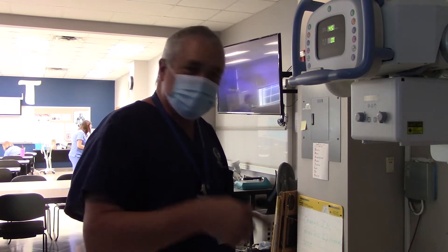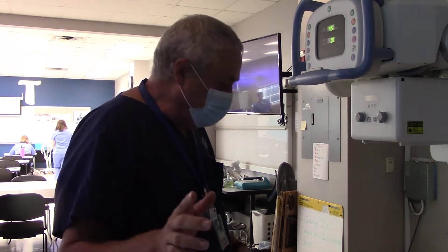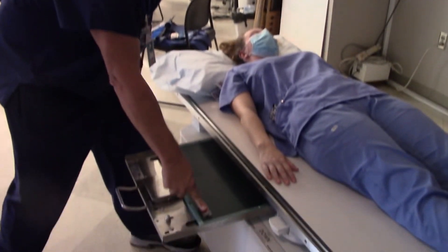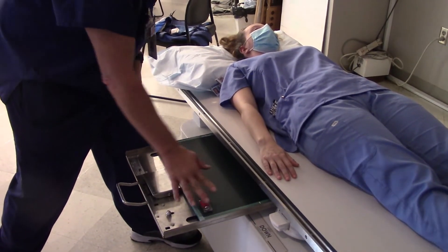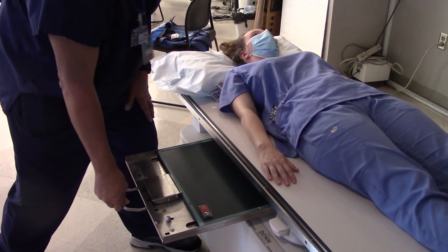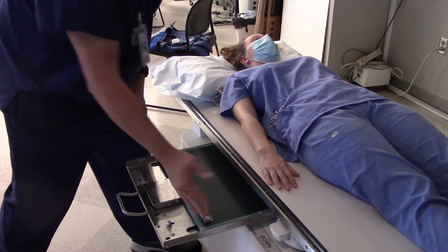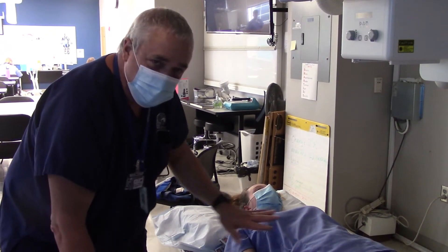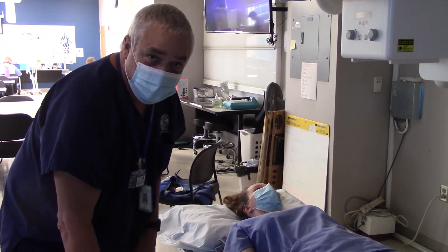For the supine, we've got our patient laying on the table with an image receptor in. We've got our marker down low — that's going to put the marker in the femurs — and we've got our right marker on just in case something goes awry. We just don't want the marker to be in our abdominal anatomy.